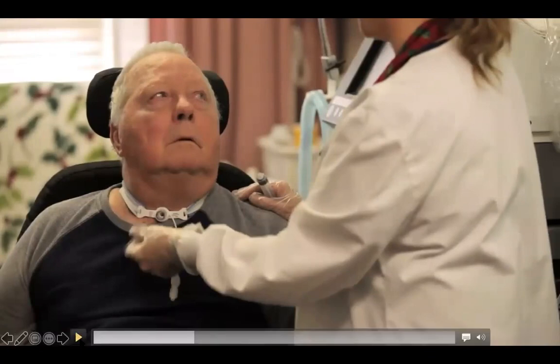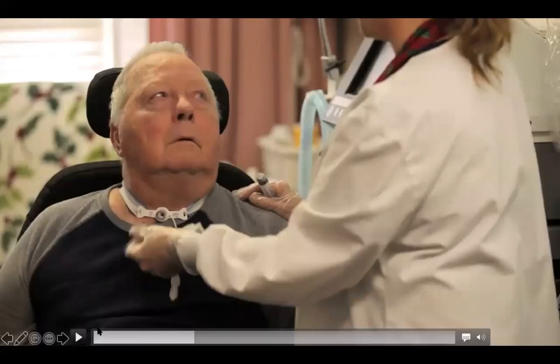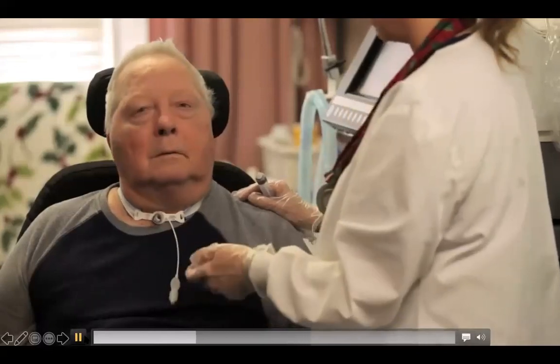And sometimes if the patient is unable to voice, if he has issues with his vocal folds, just to make sure that the air is escaping freely, you can ask the patient to blow for you. You can bring a mirror next to his nose to see if there is some fog on the mirror, just to make sure that there is some air circulating into his nose and mouth, which means that the air is escaping into the upper airway.